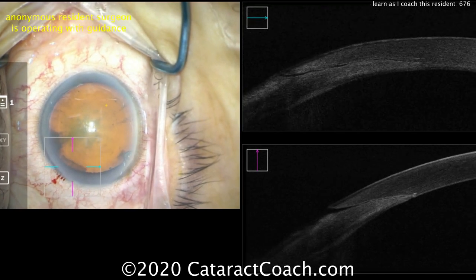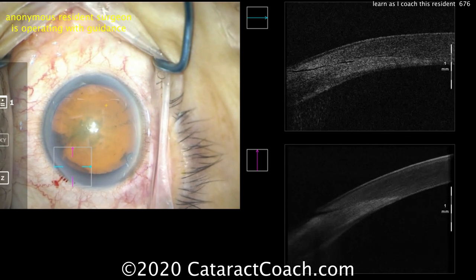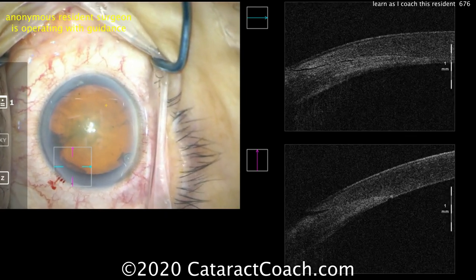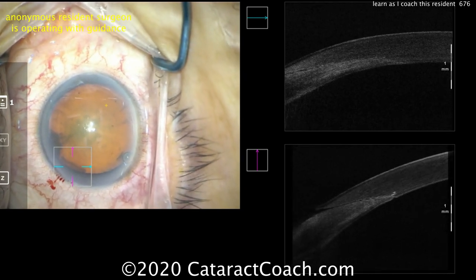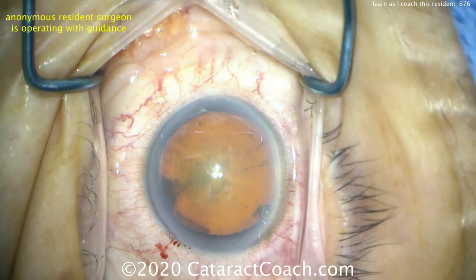Let's look at it with the OCT. You can see in that live view of the OCT that incision looks great — very nice tunnel length, great symmetry. The roof and the floor of the incision are just about identical in both those cross-sectional slices. That is fantastic. Great job with the incision — good teaching point there.